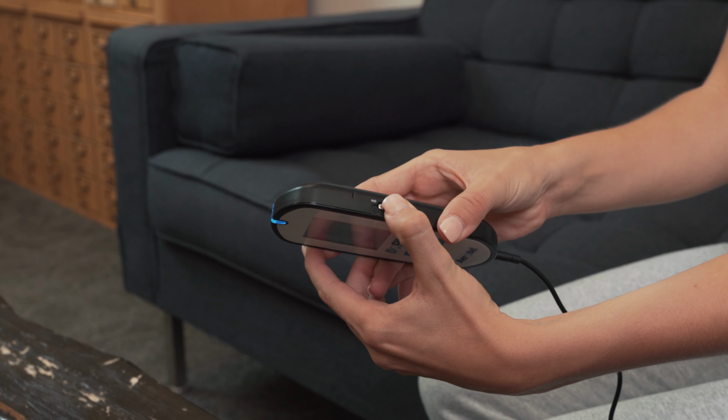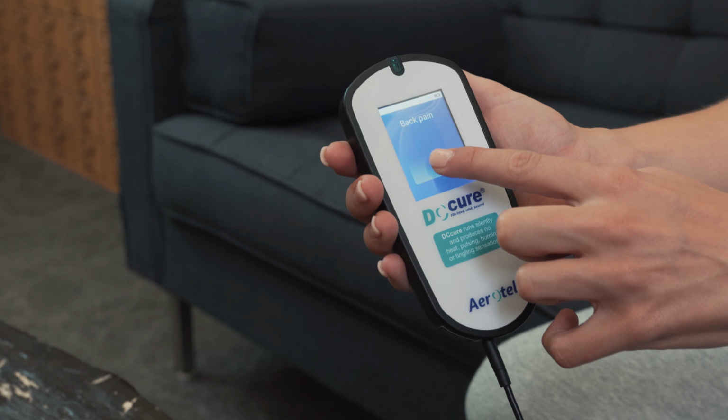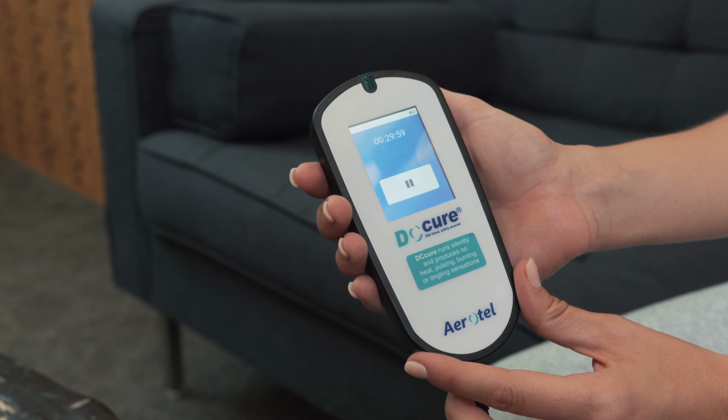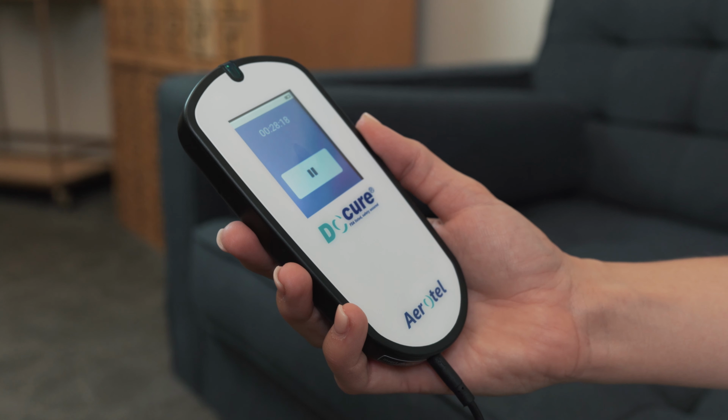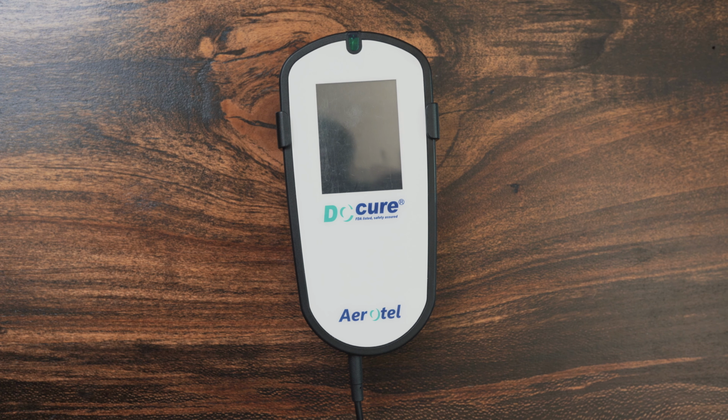Slide the power switch on the side of the unit from the off to on position. Low back pain treatment will appear on the display. Quickly tap the start symbol to begin. The LED on the top of DC Cure will flash blue while it is on. A time remaining clock will appear counting down from 32 minutes.